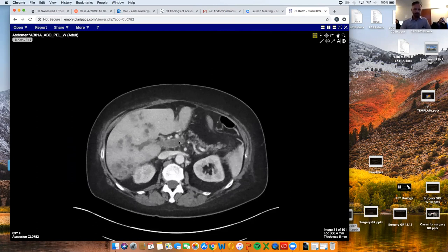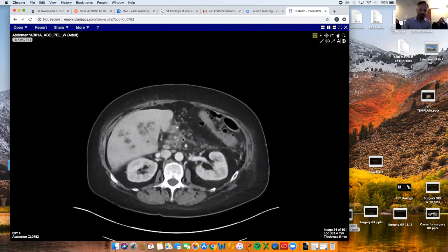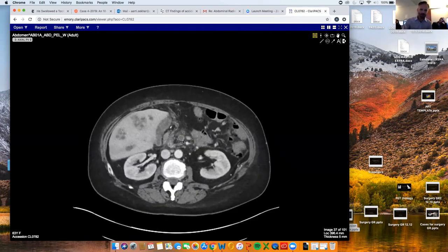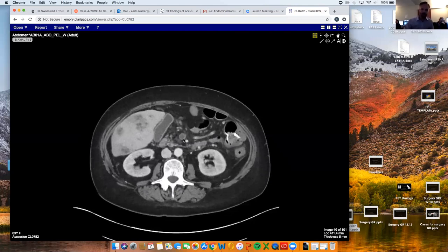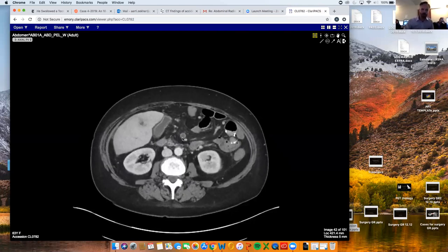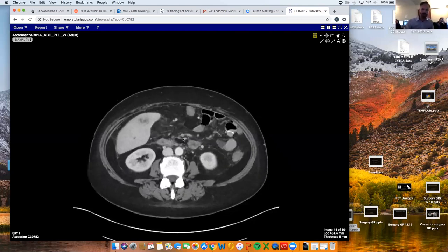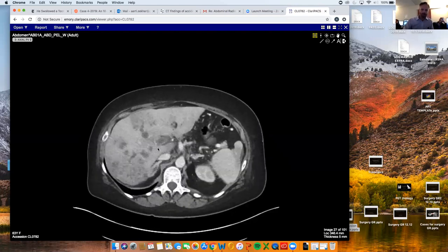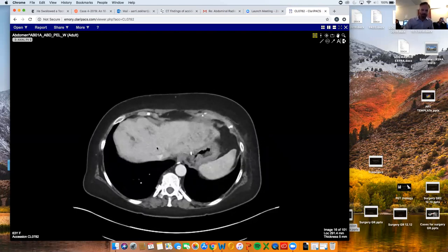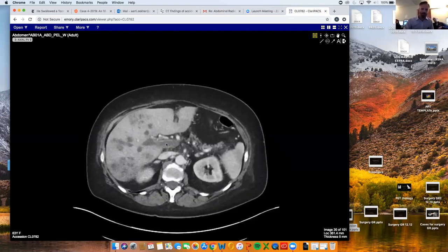And then we keep coming down. We look at this superior mesenteric vein and see this thrombus with surrounding enhancement of the venous walls coming all the way down the SMV. So basically from this, we can tell she's got massive portal venous thrombosis.